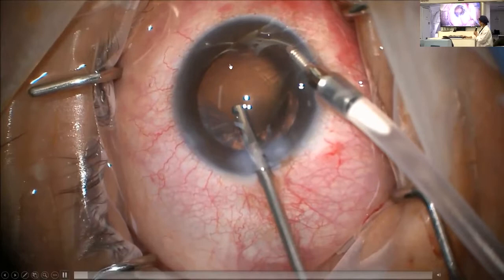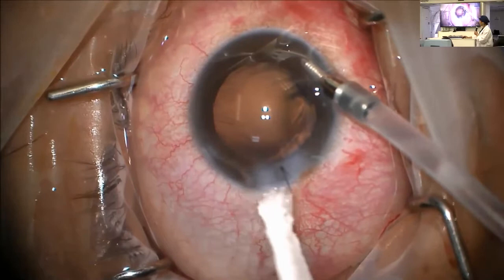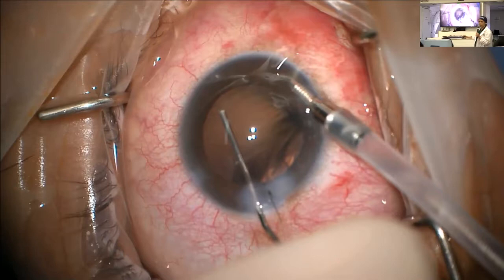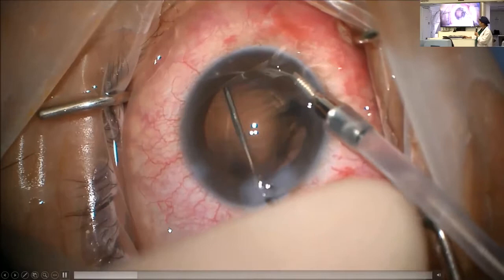Here there's been a posterior capsule rupture with an intact anterior capsule. We're using the anterior vitrectomy to clear the vitreous and remove any residual soft lens matter. We have an AC maintainer in the eye, which is very useful with vitreous loss because it keeps the anterior chamber stable — one thing that brings more vitreous forward is if the AC keeps flattening. We've put a suture into the main wound because fluid coming out of that wound with vitreous loss just brings more and more vitreous forward.